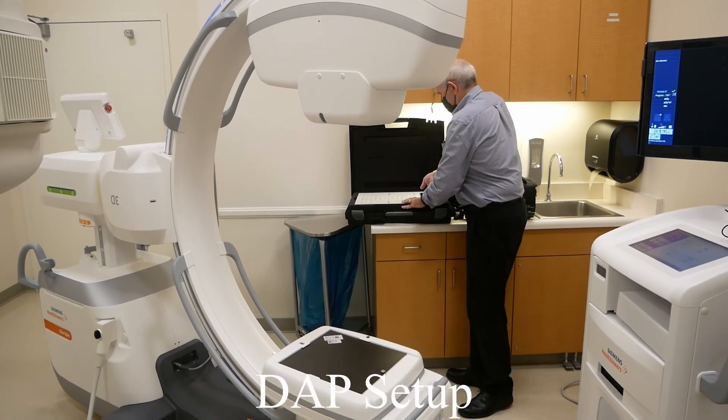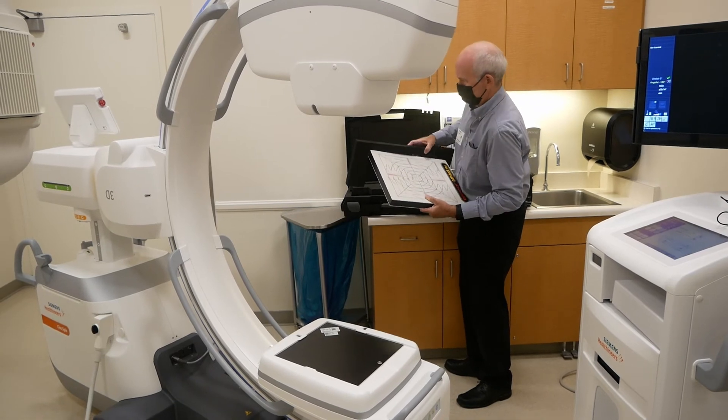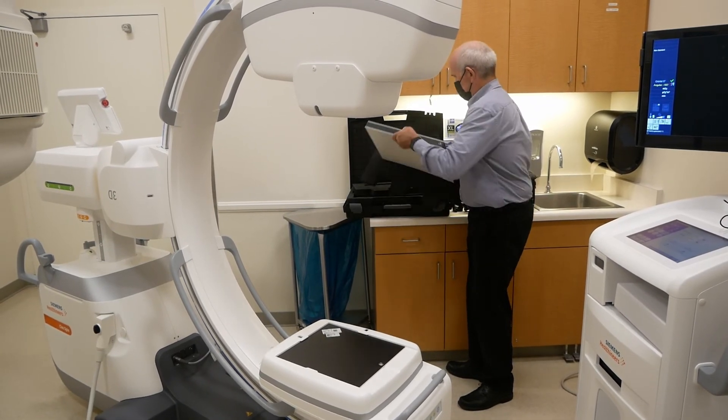For DAP measurements, do not place the sensor directly on the image detector as the DAP will read high due to backscatter. You can use the foam stand that is supplied with the case.